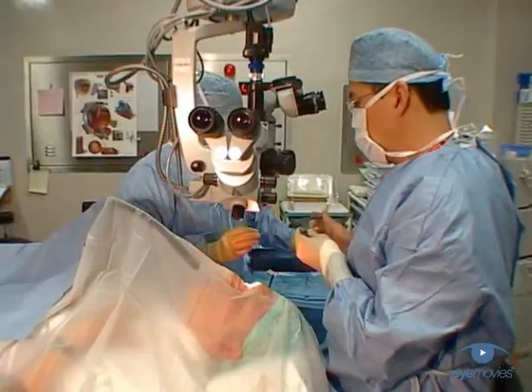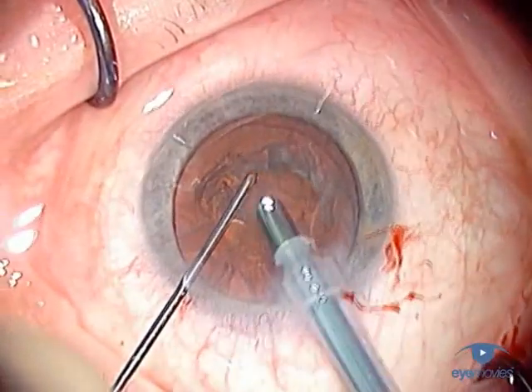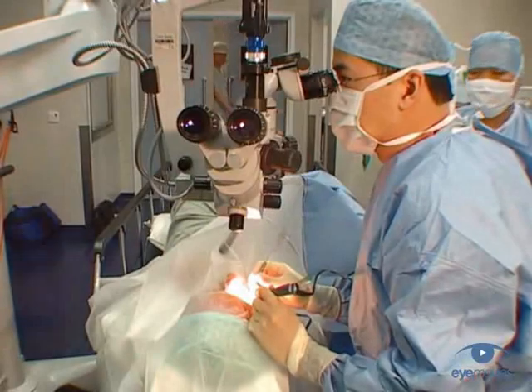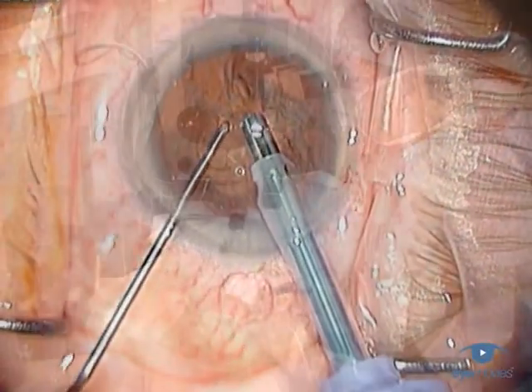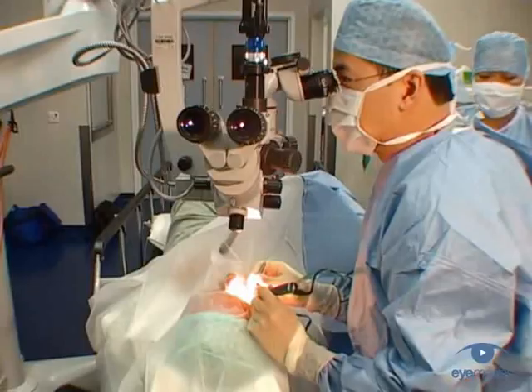Next, you have to decide on its circumferential location. Most surgeons are more comfortable operating from above to begin with, and move around to the side later on when they're more experienced. The temporal approach can give better access in difficult cases, and temporal clear corneal incisions may induce a little less astigmatism. You have to decide for yourself what works best for you. Above all, do what's safest in your hands.